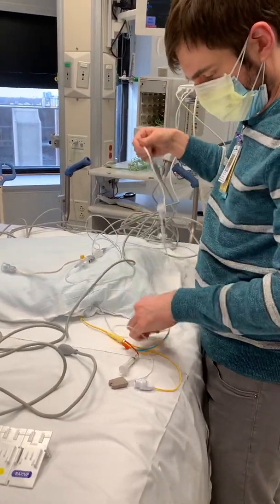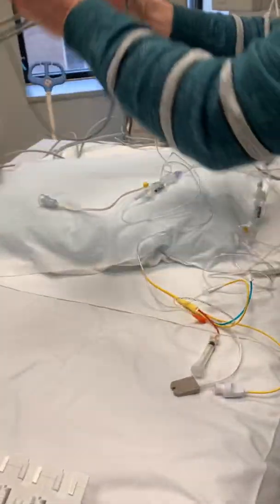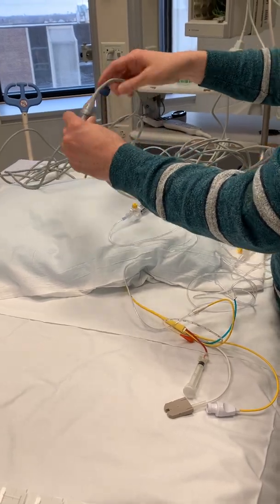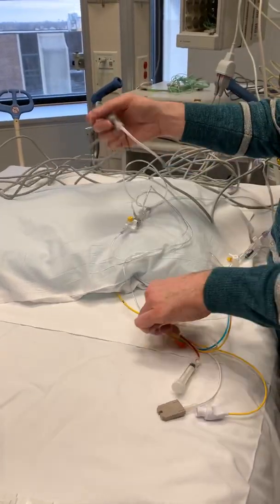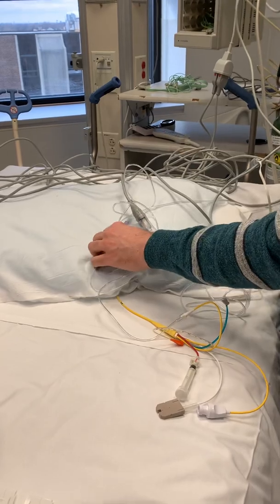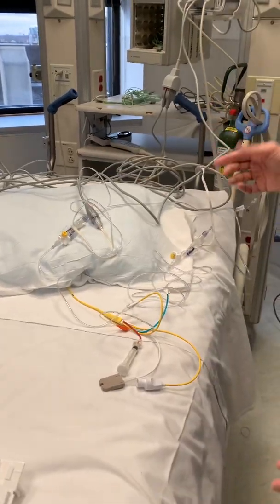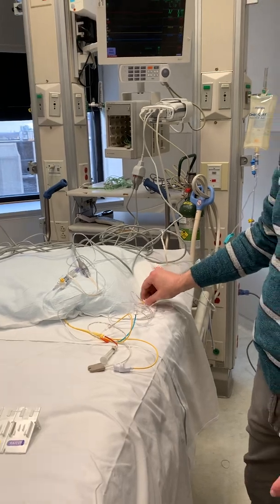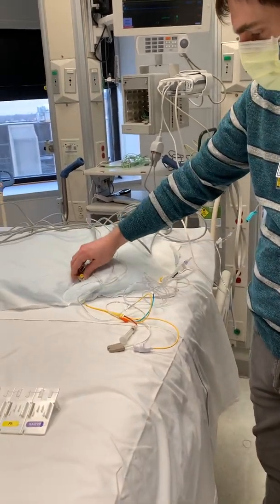Now we've got our CVP there. Then our other cord is going to be our PA. So then that's really it — this has been flushed, now we've connected everything. All we have to do is zero these and we'll get our tracings.